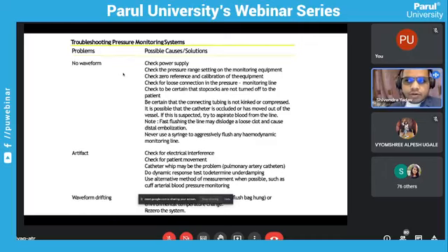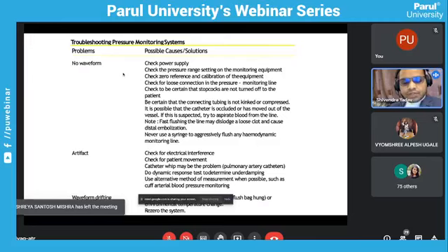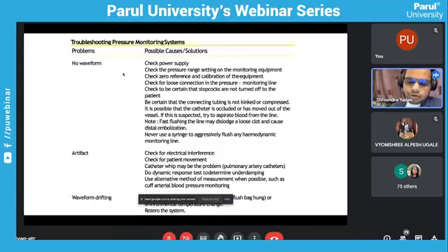This is very important. You might be at the lower scale. Let's say you're recording an aortic pressure. Normal aortic pressure is 120 over 80, so you need a higher scale, between 0, 100, and 200. But if your scale maximum is 50, you may not see that aortic pressure because it is above the range. So you should always set a proper scale to get the recording. Always check what cardiac chamber pressure you are recording, and whether the pressure scale is accurate for that particular pressure.